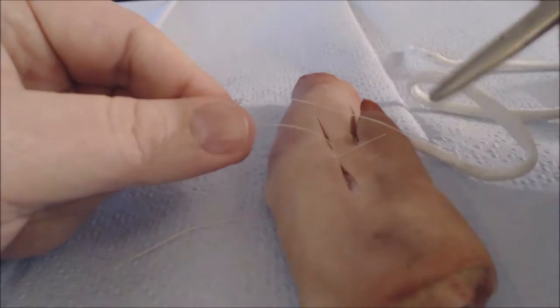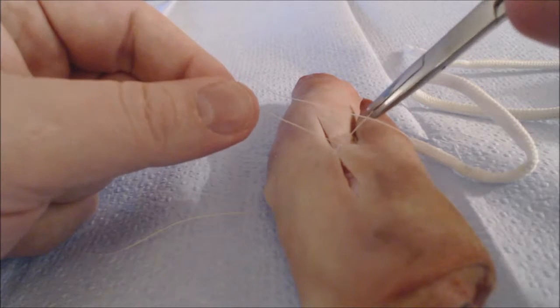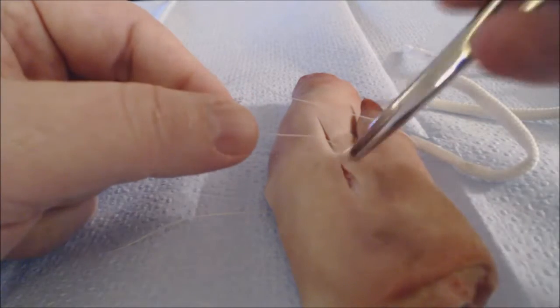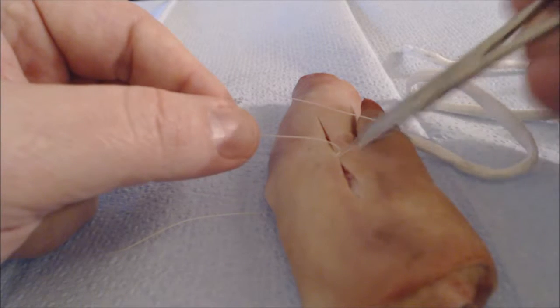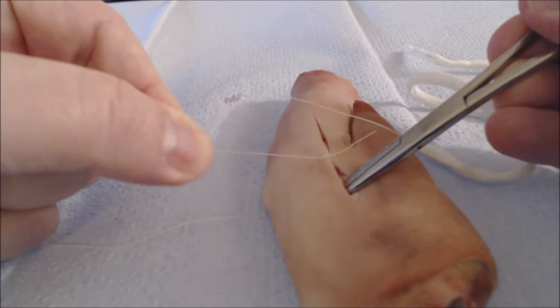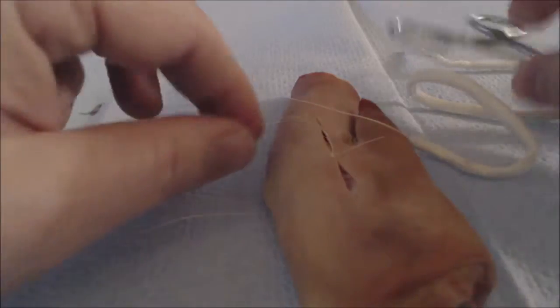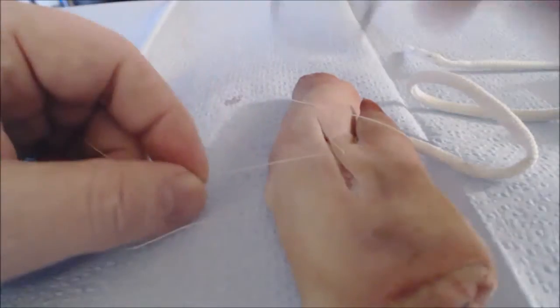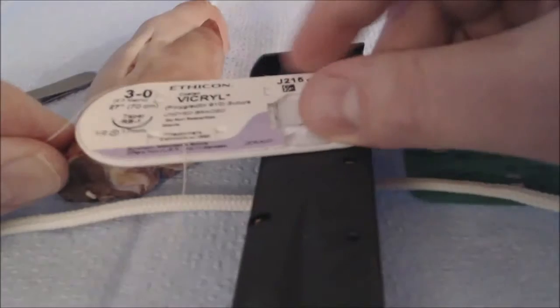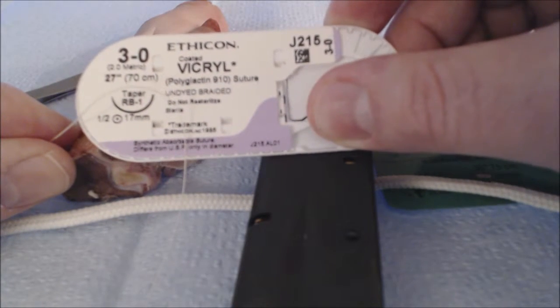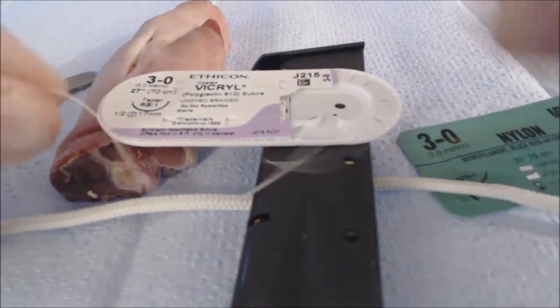The nice thing about this particular suture material is that it won't slip very far. We're using a vicryl or braided material at this point, and so the braids within the material itself catch the other material and help lock the knot. If we're using a fishing line type monofilament suture, then when you make a slipknot, the knot will slip much easier away and out when there's tension put on it. If you're not sure whether or not you made a square knot after you've put in your suture in someone, then what you'll have to do is put in knot after knot after knot. We've been using a braided material, vicryl. Another braided material that's commonly available is silk. And when you run your fingers down it, you can feel notches in it. Those notches help lock the suture.